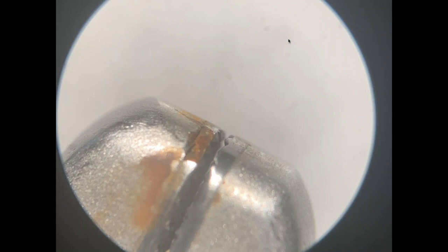But it's obviously a really crucial point that if we can't see these issues or these small areas of damage to tungsten carbide with the naked eye, then you really do need to be using a magnifying glass or some sort of magnifying inspection lamp to look at this closely. I think you mentioned that earlier, Bob, about the TC needle holders and the inserts, right? Absolutely. Enhanced visual inspection is so important, especially when folks start getting my age, when they have all the gray in their beard.